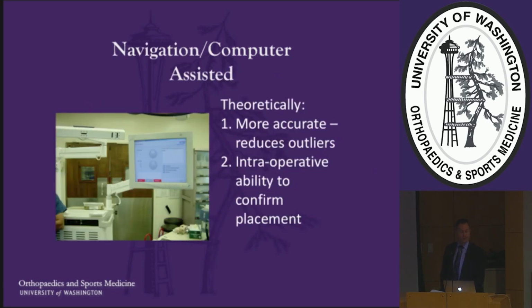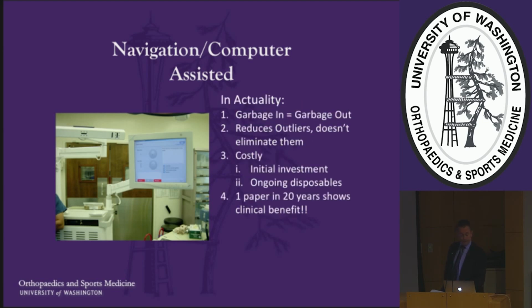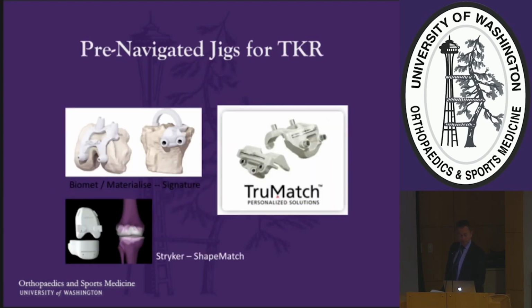We just talked about navigation. And theoretically, it is more accurate. And you have this ability to confirm placement. But the fact of the matter is that it reduces outliers. It doesn't eliminate them. It's costly. And only very few papers show any clinical benefit whatsoever.